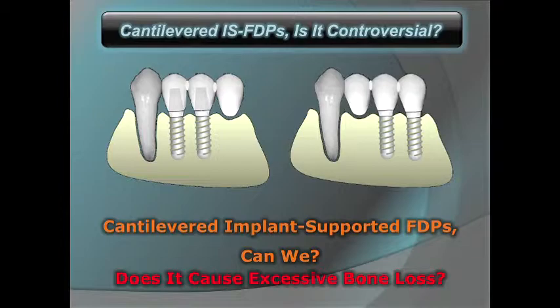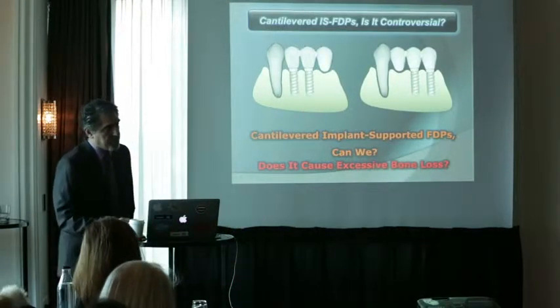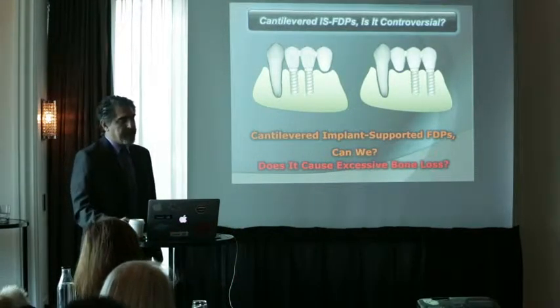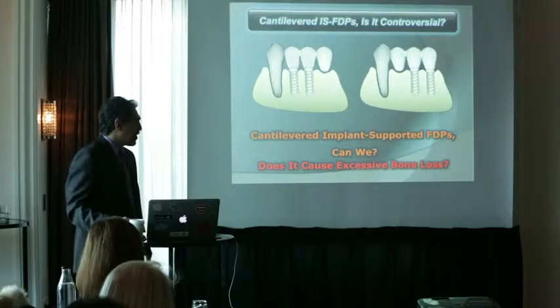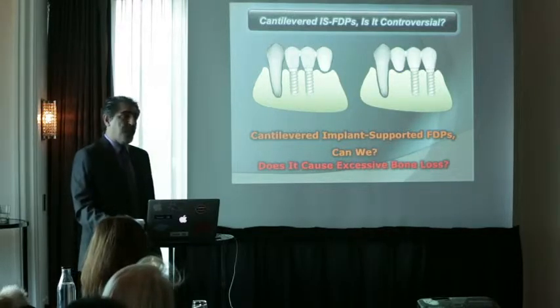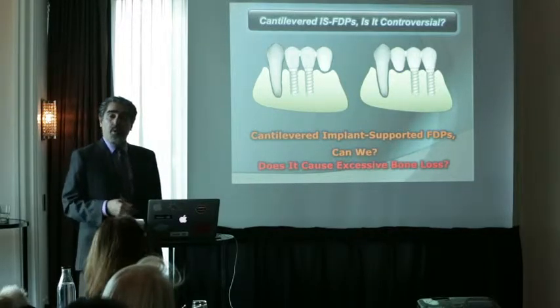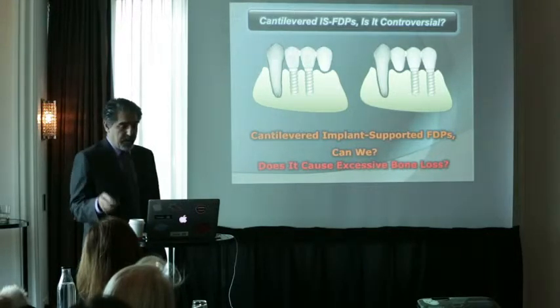Now let's go to kind of a controversial, is it controversial or not? Cantilever implant-supported fixed dental prosthesis. Is it possible? Can we have this sort of design without being afraid of bone loss? Because that's one of the issues, and it's always been talked about.